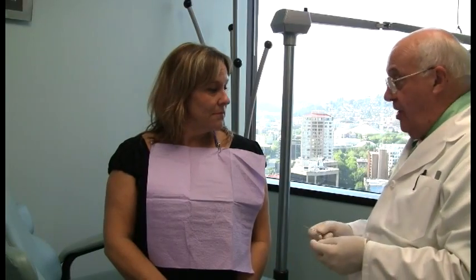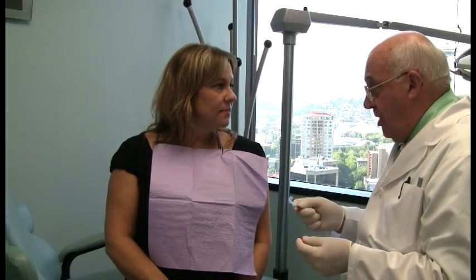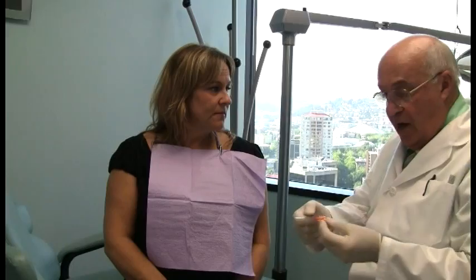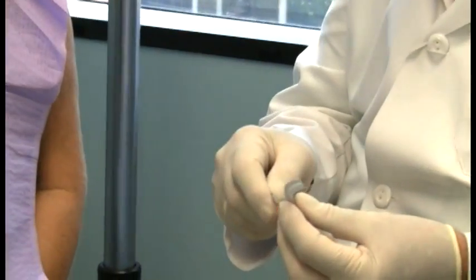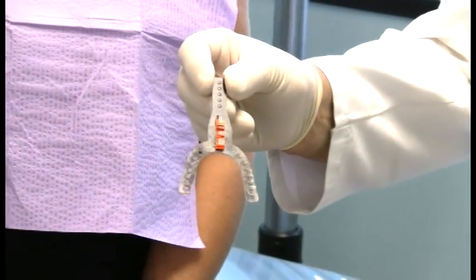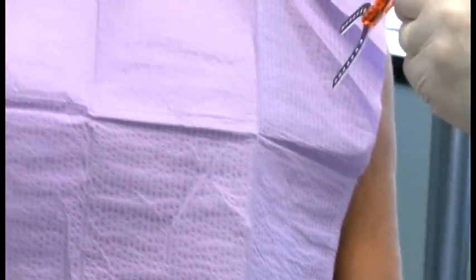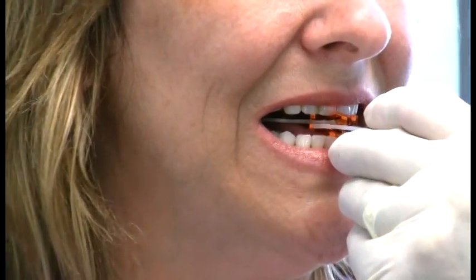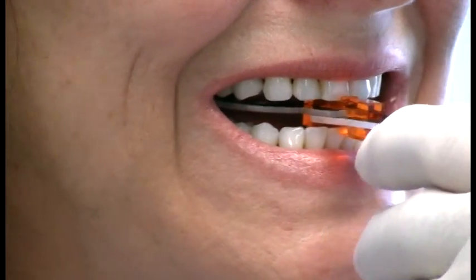Now we've decided that the end-to-end at 6 millimeter was the most comfortable and had the most significant change in your airway. So now we are going to get a bite registration, and I'm using the notches that I pointed out earlier at either end of this, and we're putting a bite fork in one side and a handle in the other, and now you can see that we have this ready to go. And so I will just fit this in on the middle notch on the top, and Teresa, close into that notch on the bottom. Bring your jaw back just a tiny bit and go right into place.